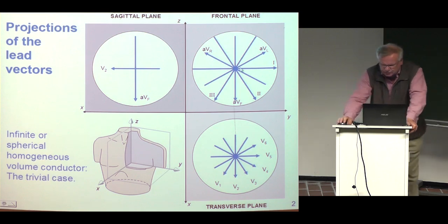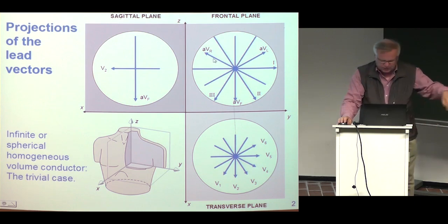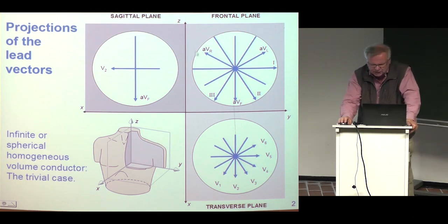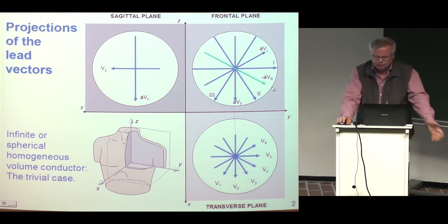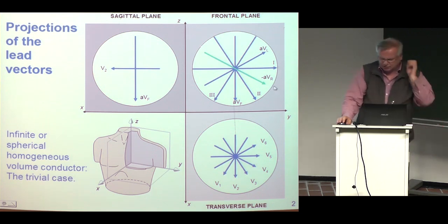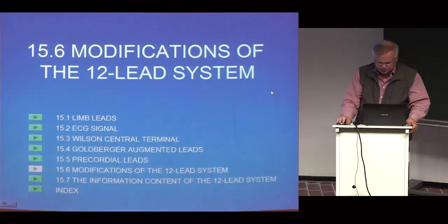In recording the 12-lead ECG, there is a standard. It is in the instrument, it is a button. By pressing it, it records minus aVR instead of aVR. And why is that? The reason is that it is more beautiful in the recording when the frontal plane vectors form a nice sequence of six vectors like this, similarly as the transverse plane like this. It is logical. It is okay.